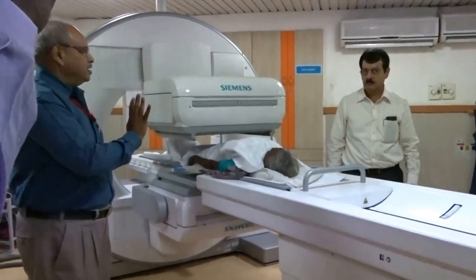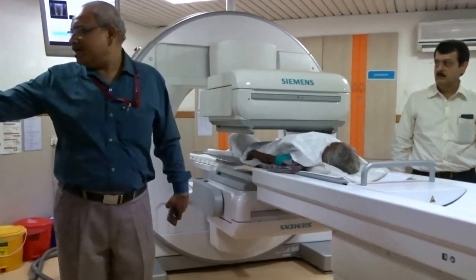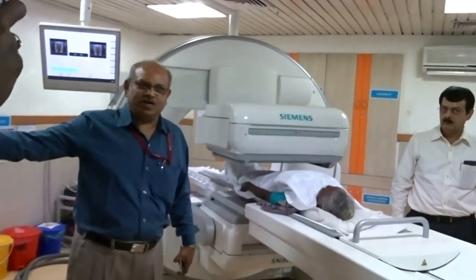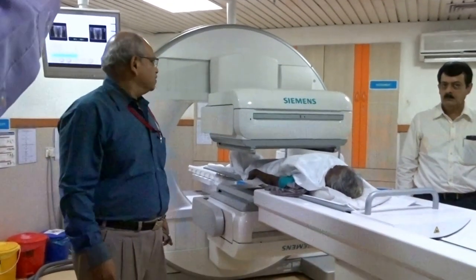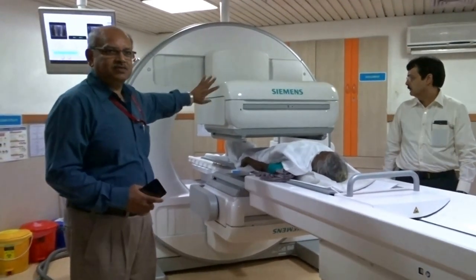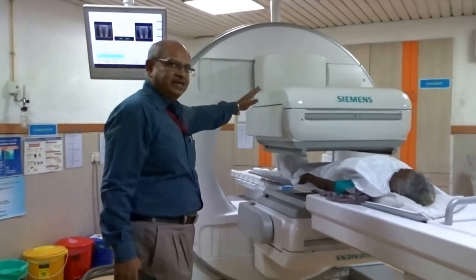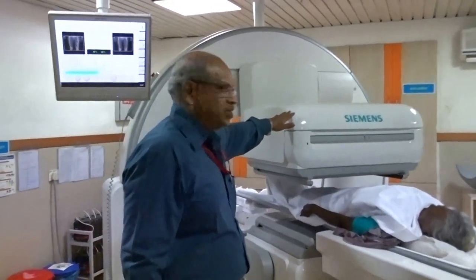The patient is lying and relaxing while the scan is going on, which we are monitoring on this monitor as well as on the acquisition monitor. The table is wide on both sides so that even a heavy patient can go very comfortably. And this is the detector — this is the one which takes the scan.